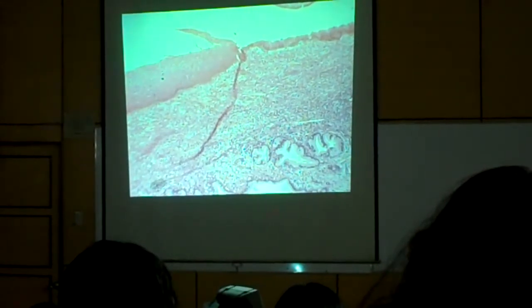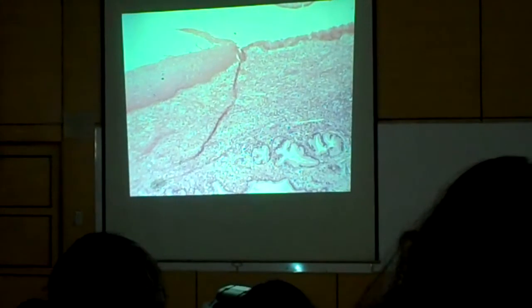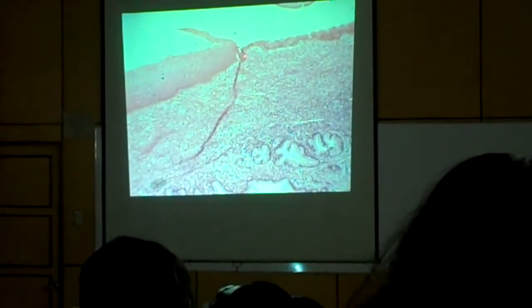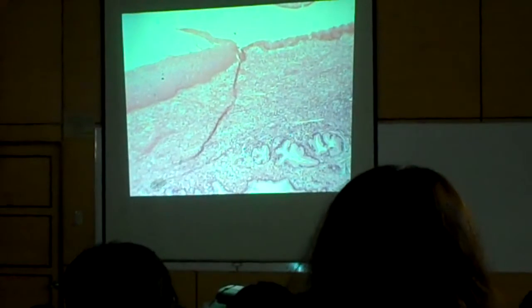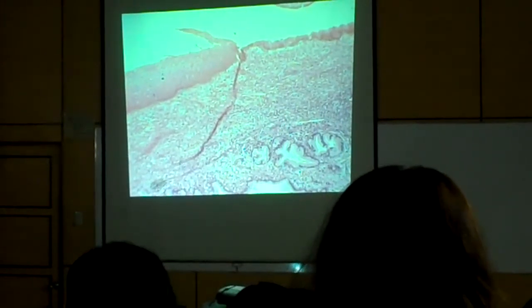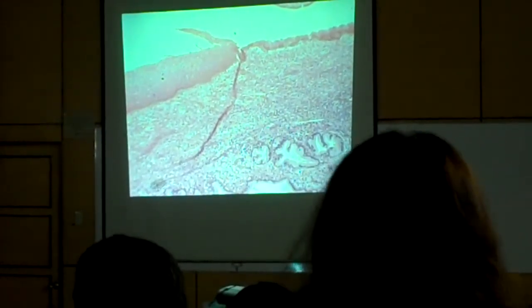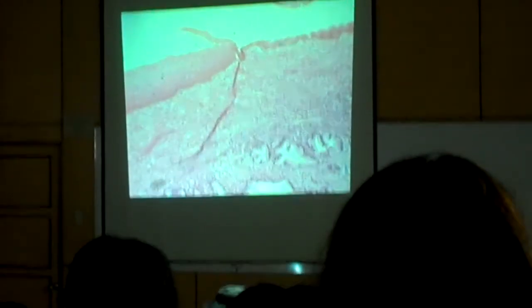Okay, identify the organ. Cervix. You know it's the cervix because you have this squamocolumnar junction. Okay. There is also a squamocolumnar junction in the GIT. But since we're only on repro and endo, if you see a squamocolumnar junction, that's the cervix.